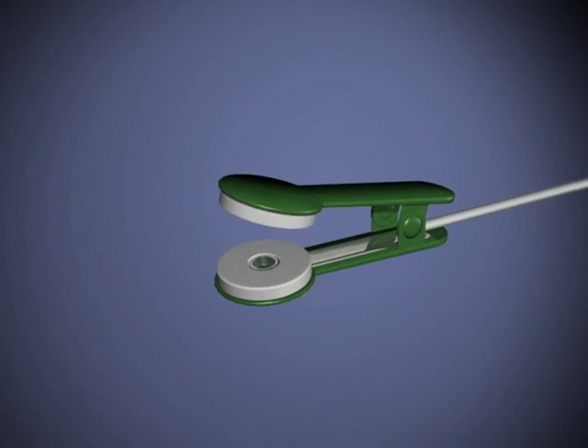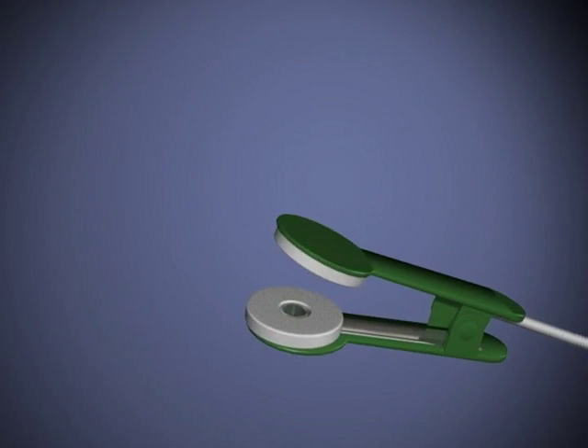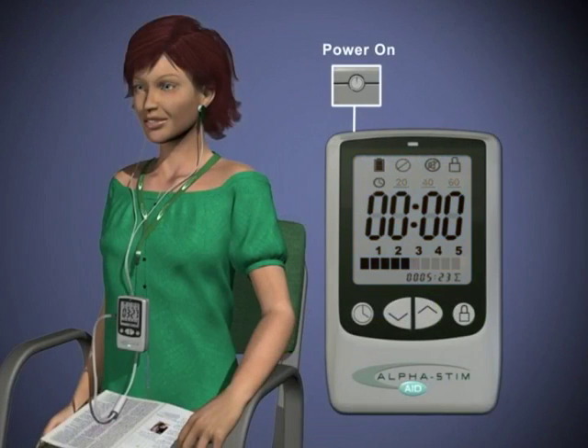Saturate the ear clip electrode pads thoroughly with several drops of alpha conducting solution while they are on the ear clip electrodes. Press power on and set the timer.